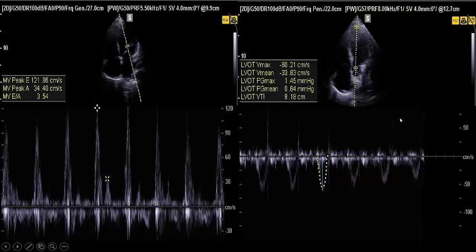That means our patient has very low stroke volume, because LVOT VTI is a surrogate of stroke volume. So very low stroke volume by very low LVOT VTI and very high left atrial pressure. That means it's going with the cardiogenic element, definitely, with a dilated non-collapsing inferior vena cava.